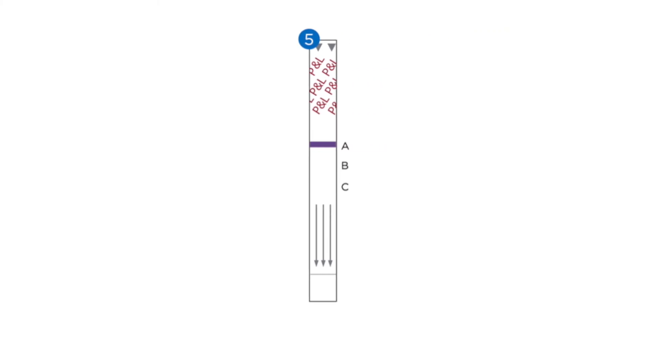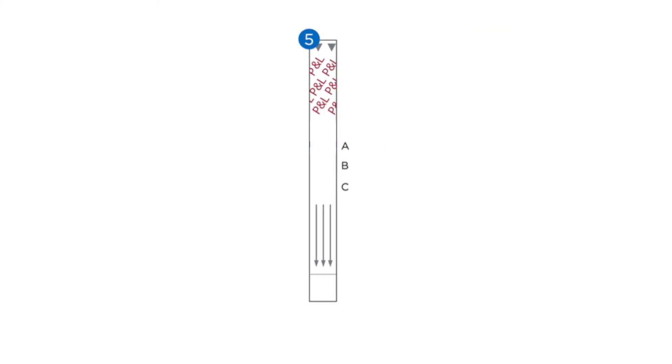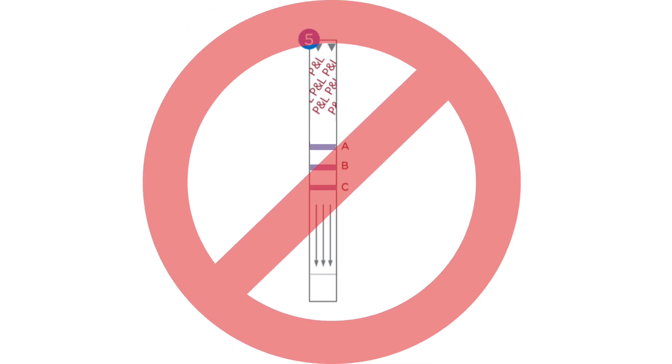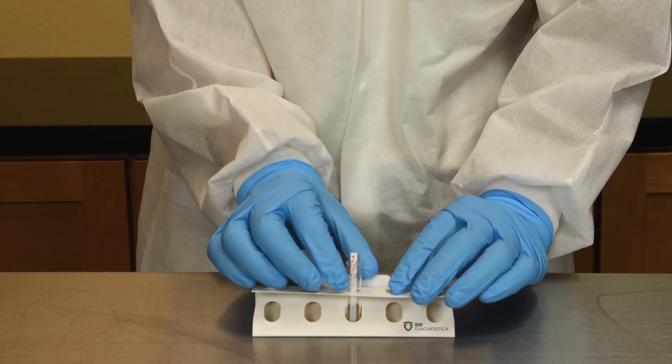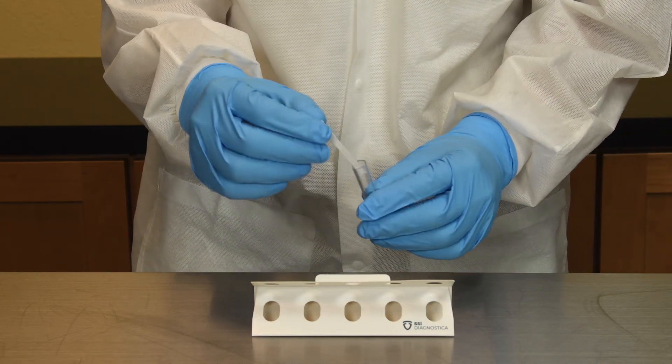Please note that if the control line does not appear, if the test lines are not the correct color, if the test lines appear as partial lines, or if the test lines show three identical gray or purple lines, the test is deemed invalid. If an invalid test is observed, follow the procedure for invalid tests found in the instructions for use. If an invalid test is observed, retest for accurate results.